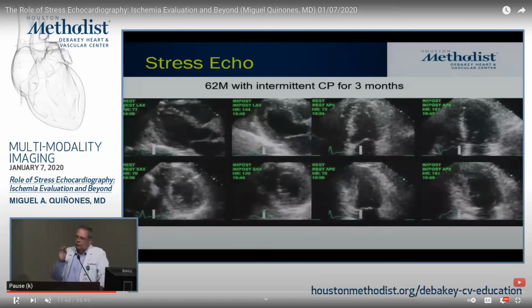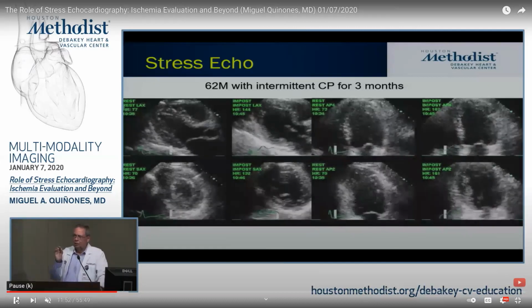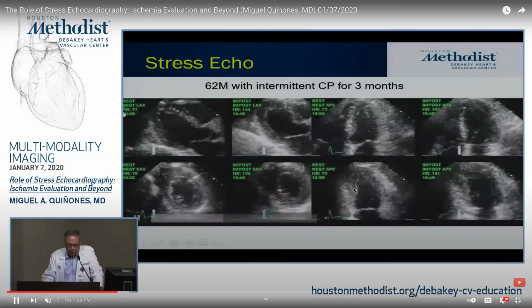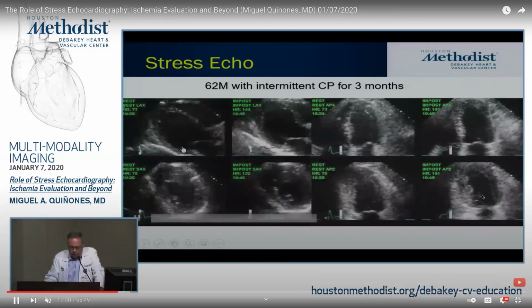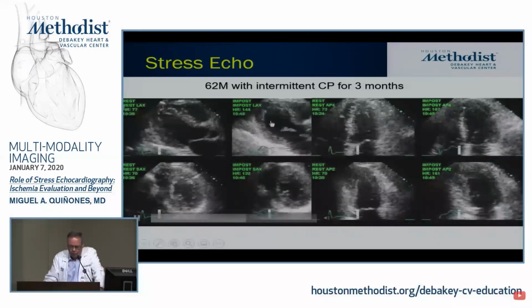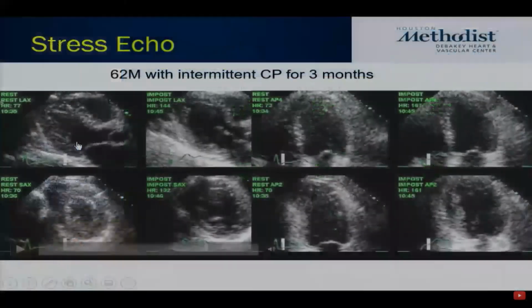And this is very good quality images. And you can imagine that if you go in and you want to really quantify the difference in the ventricular function from this to this, you've got questions like, is it exactly the same plane? Did the heart change its shape, etc. But then an expert, when they're viewing it, there's no question you can see a difference, right?